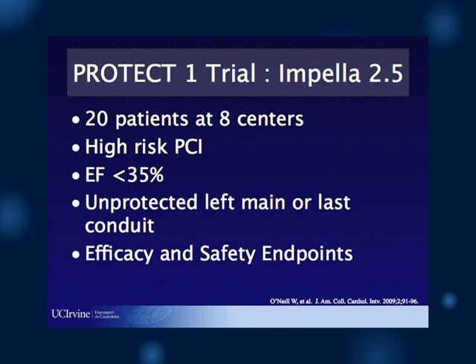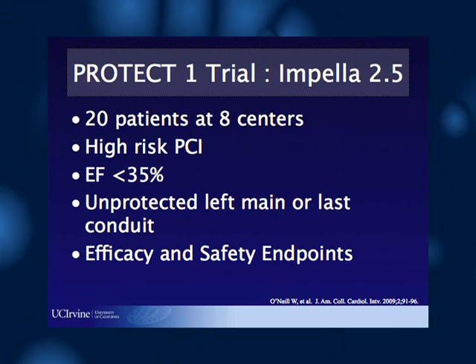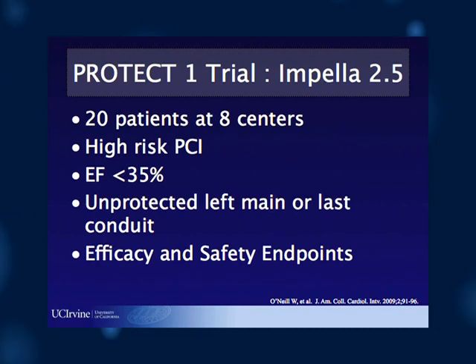The PROTECT 1 trial using the Impella 2.5 device involved 20 patients at 8 centers. These were high-risk PCI individuals with ejection fractions of less than 35%. They either had unprotected left main stenoses or last available conduit supplying the myocardium.